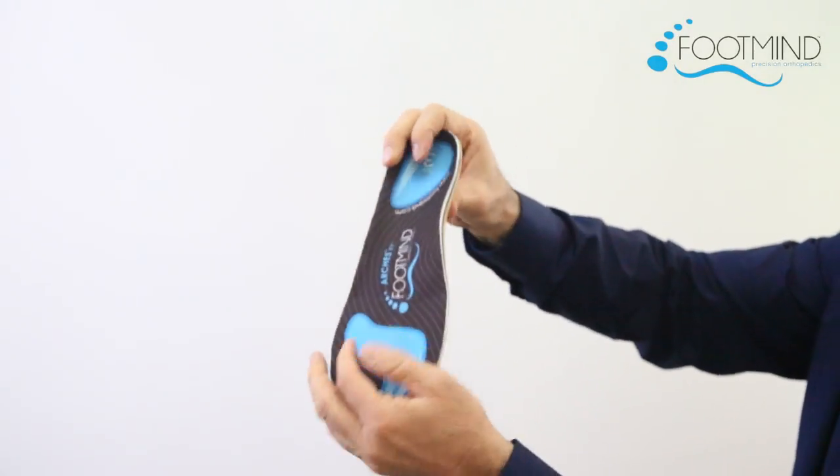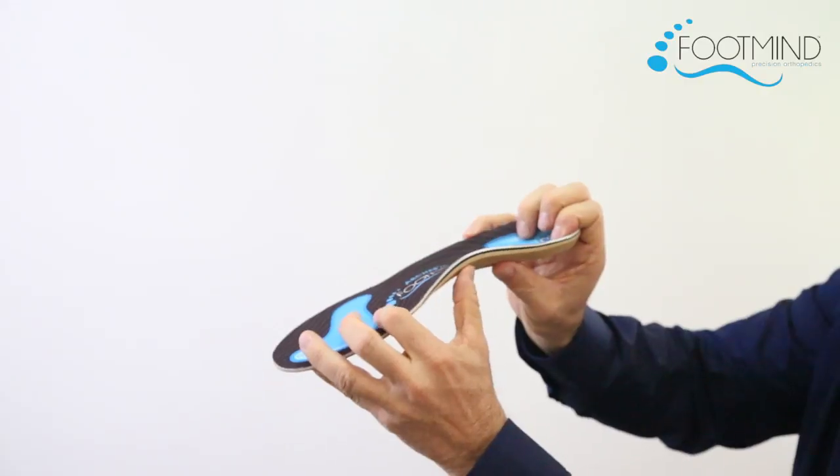A full-length orthotic that is semi-rigid and semi-soft, relieving pain but correcting motion in your foot, ankle, knee, hip, and back.